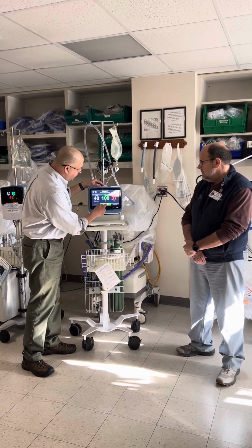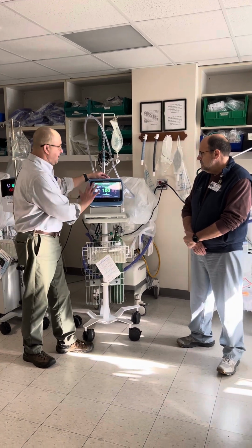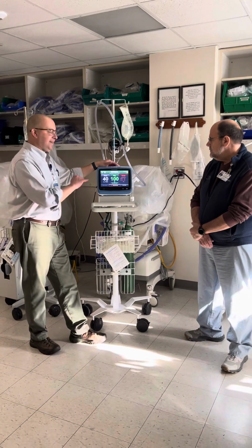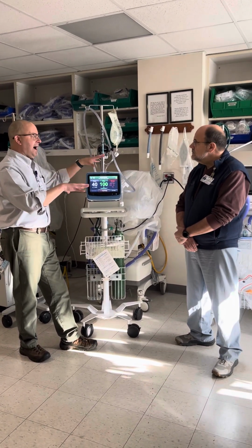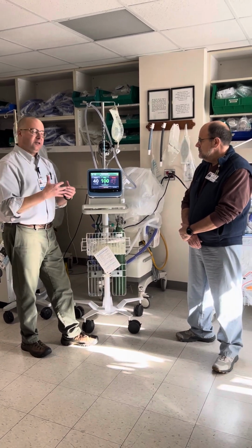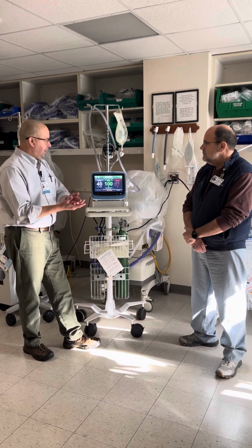When we start the therapy, the patient will be on 40 liters a minute and 100%, which is where we start all of our patients. That's kind of Vapotherm's big thing: start high, capture the patient, and then wean down, as opposed to starting low and titrating up, because a lot of times you lose the patient.